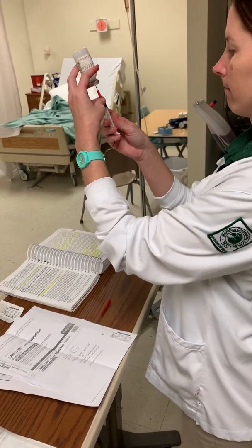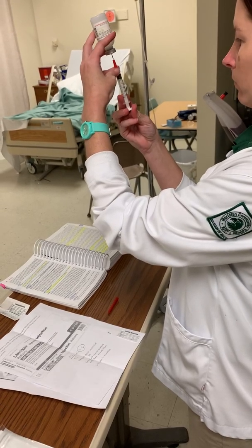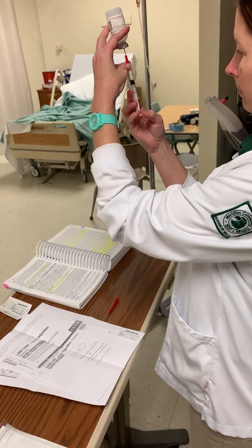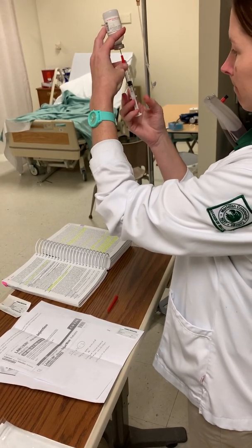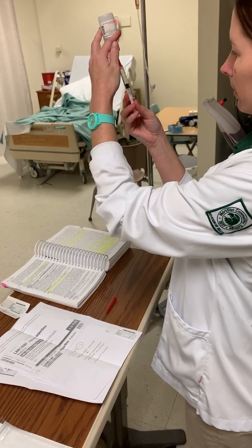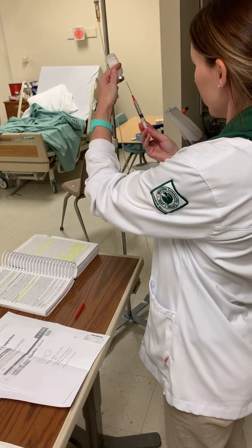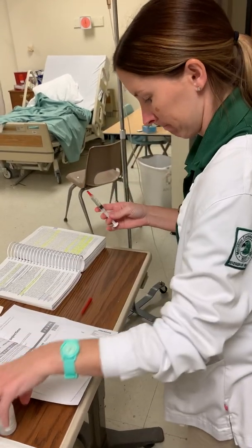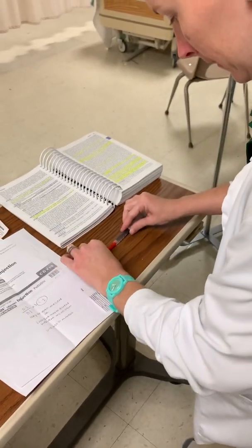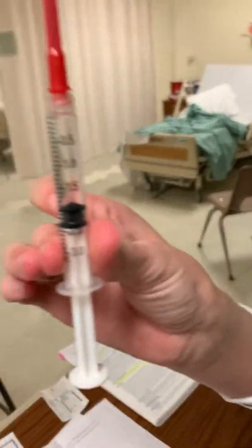I'm going to draw it up, making sure I don't have any air bubbles. Okay, and I'll show you that I have 2 mLs.